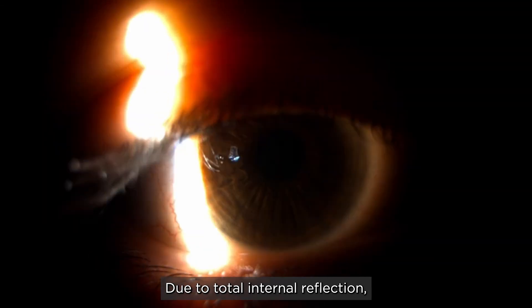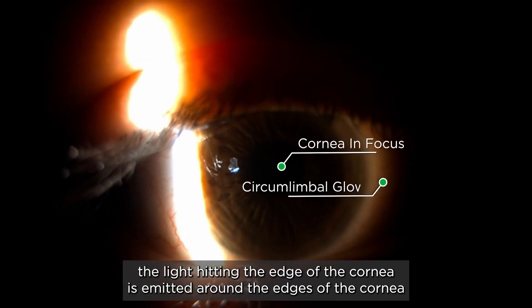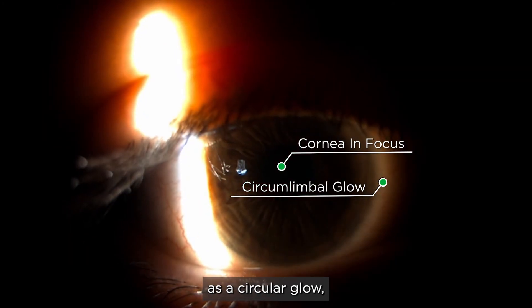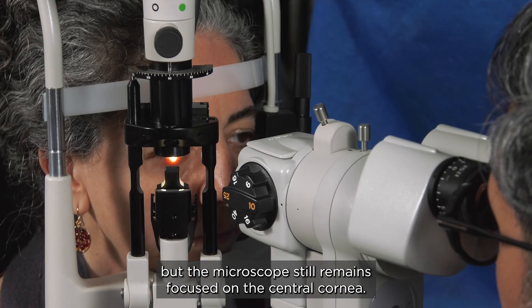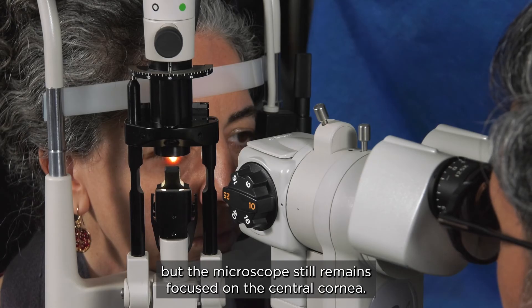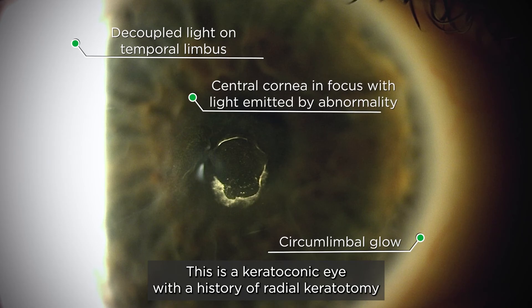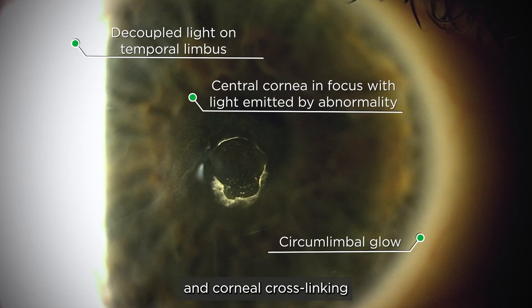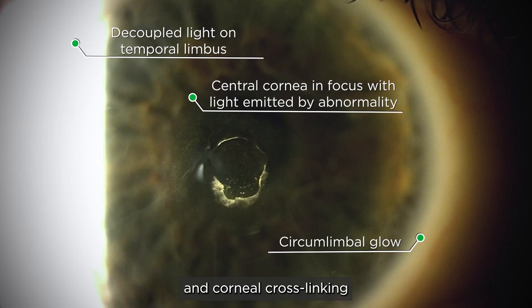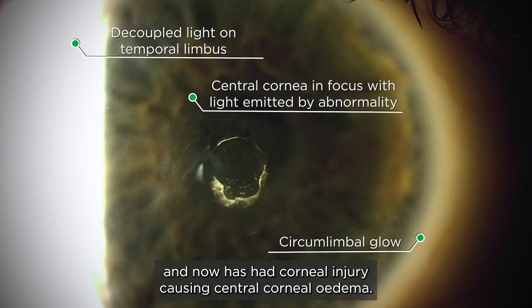Due to total internal reflection, the light hitting the edge of the cornea is emitted around the edges of the cornea as a circular glow, but the microscope still remains focused on the central cornea. This is a keratoconic eye with a history of radial keratotomy and corneal cross-linking, and now has had corneal injury causing central corneal edema.